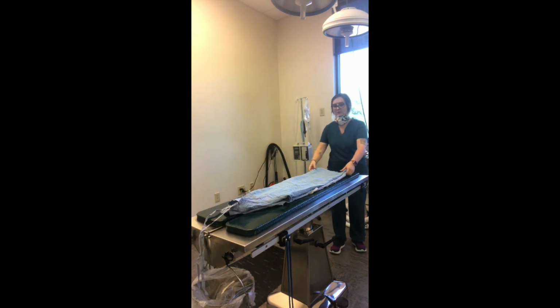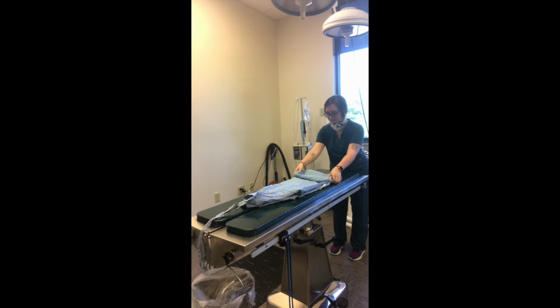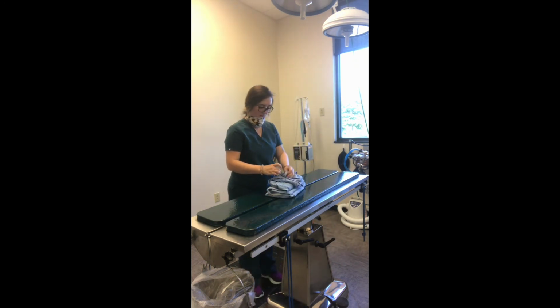And we're going to fold it in an accordion style. Then the neckties are going to be on the top.